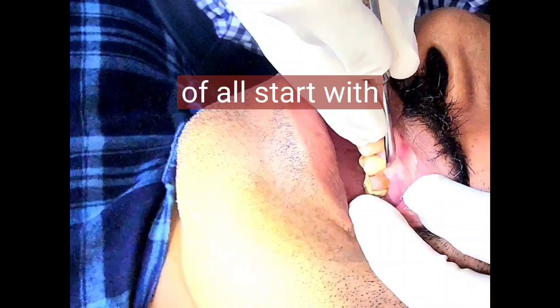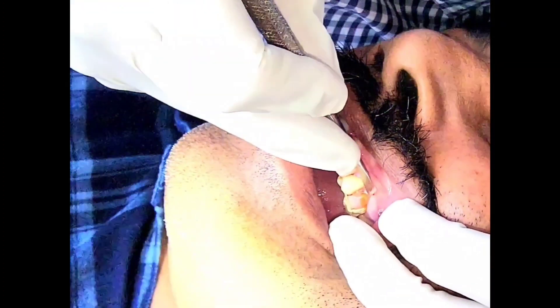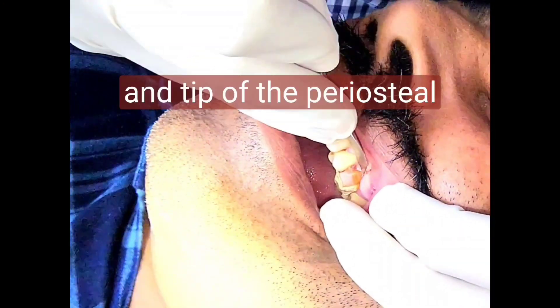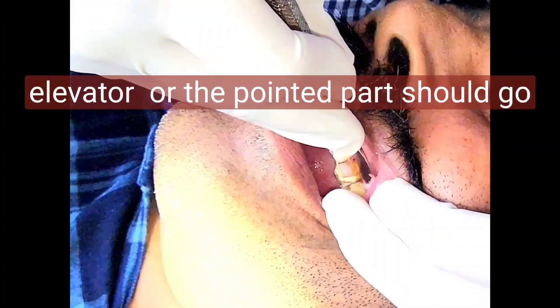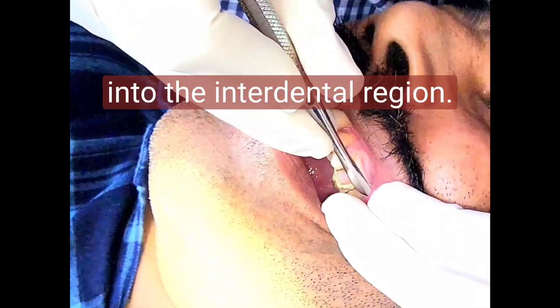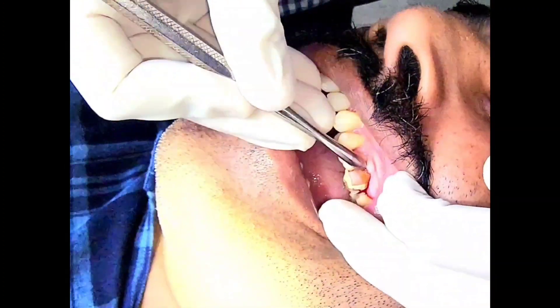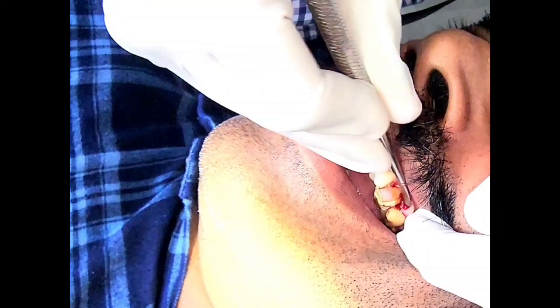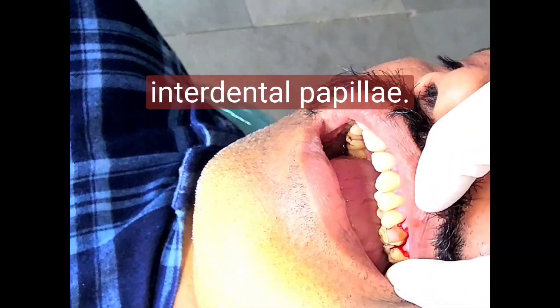First of all, start with resting your fingers on the adjacent teeth. The pointed part of the periosteal elevator should go into the interdental region. Move it — roll it as you advance — and reach the next interdental papilla.